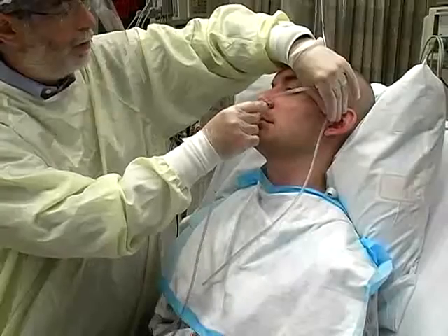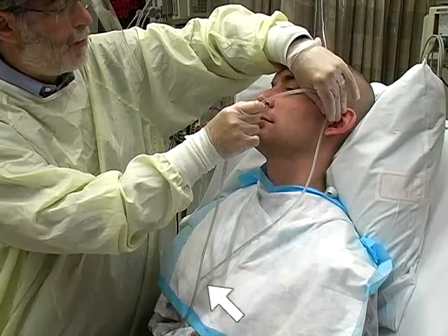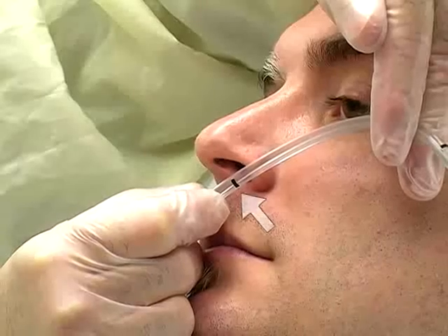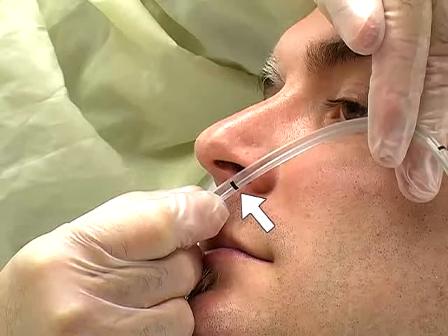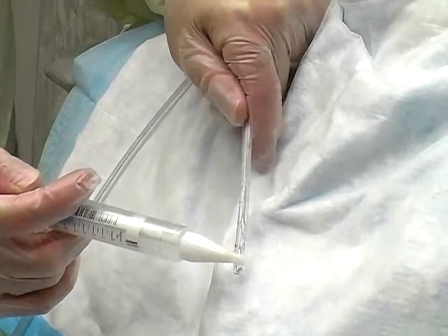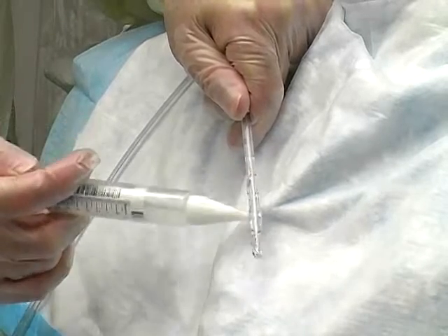Estimate the proper depth of insertion by measuring the distance from the xiphoid process to the ear and then to the nares. Note that black marks are inscribed on the tube for visual reference during tube advancement. Finally, lubricate the tip of the nasogastric tube either with viscous lidocaine or surgical jelly.